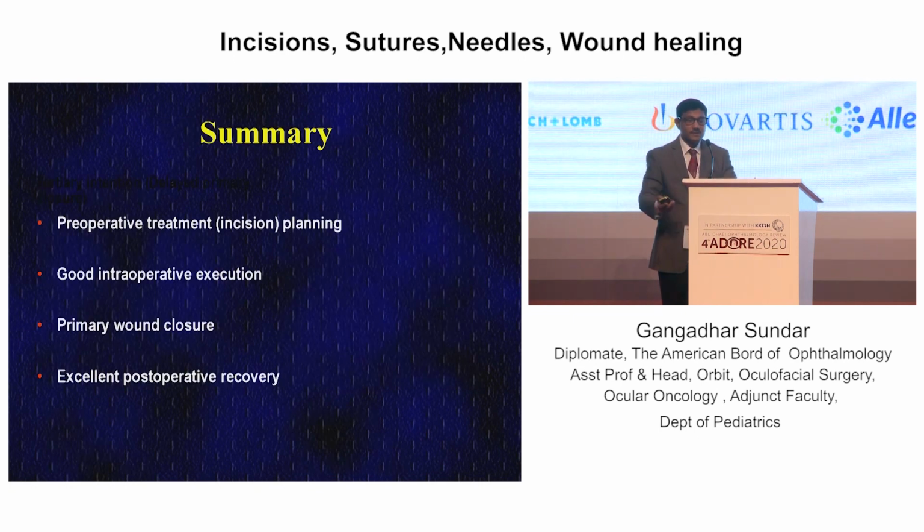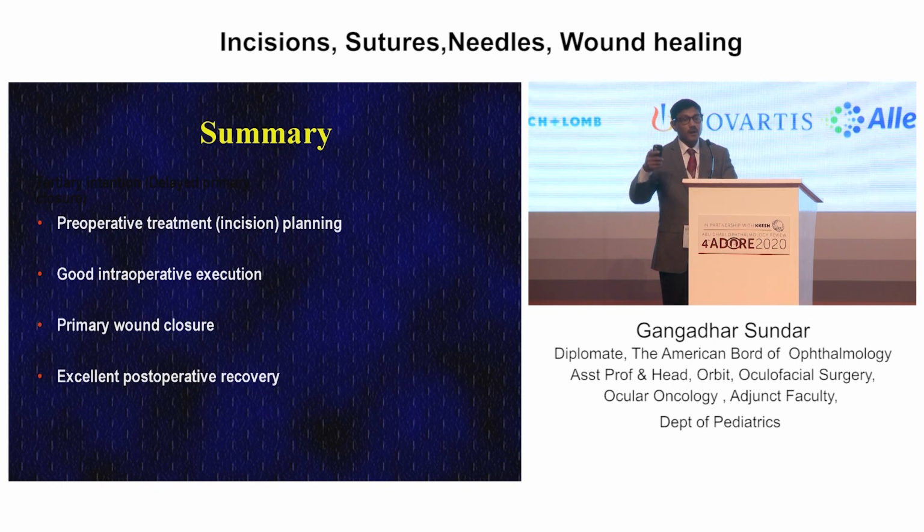back and closing itself. So in summary, I touched very briefly on the various incisions, sutures, needles, and various applications. Most of this is decided preoperatively, but every once in a while you want to be creative on the table so that you can modify techniques itself. You have to execute good intraoperative technique to follow through on the preoperative treatment planning, aiming for primary closure so that you get excellent postoperative recovery. Thank you very much.